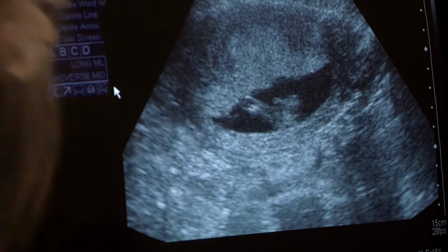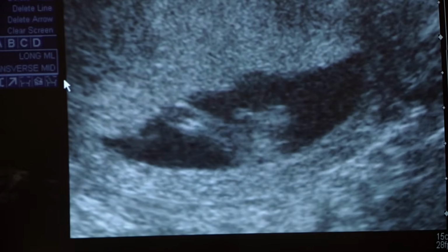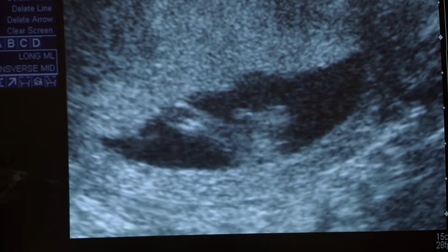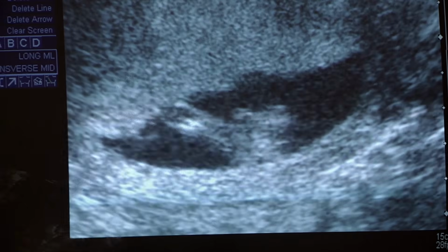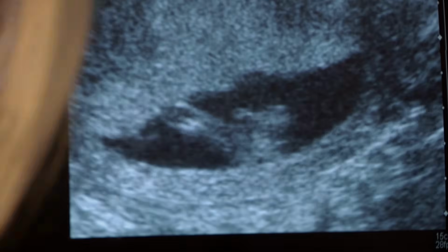Yeah, there's my boy. That definitely looks like a boy. Yeah, that does. Let me see if I can make it bigger. Ah, there we go. That's the bottom of it, and then that's the... Here's the penis, and here's the little scrotum. Part of a little part of the butt. I would give you a picture. Don't hold it against me. No, it looks like a boy. She just wants to give it to Mark, or see if he can look at it and see what it is.